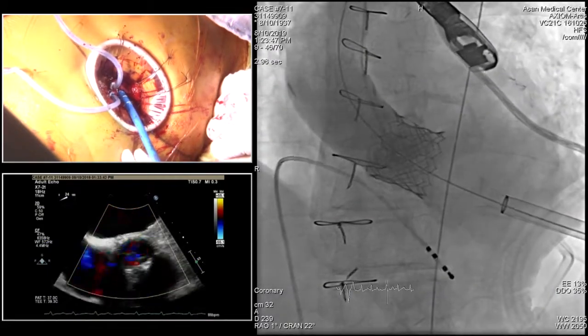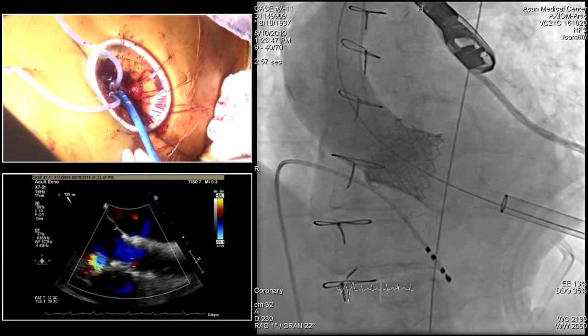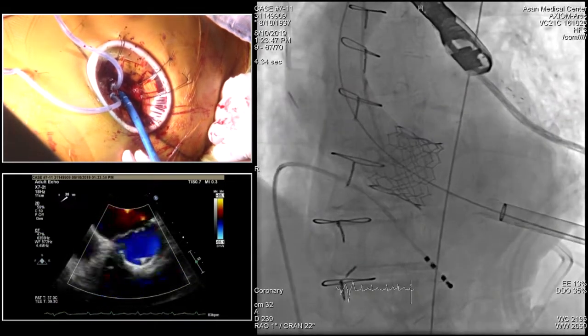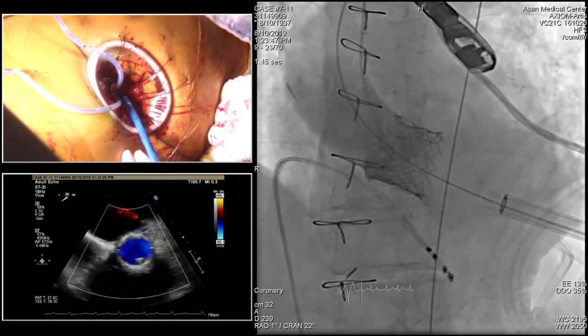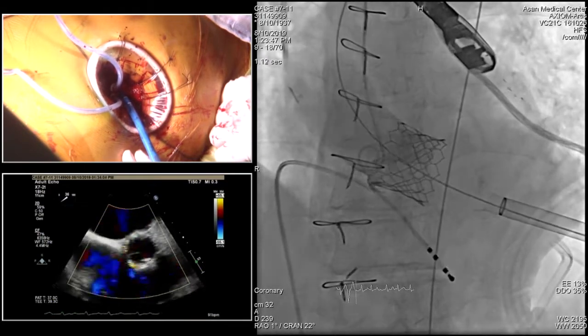17, 그럼 2 cc로 맞춰주세요. 2 cc 오버필. Okay, we're going to do 2 cc. 그럼 18%. So you're gonna do post dilate? Yes. 17%. I'm gonna do 2 cc overfill. 예. 아까 2 cc overfill 한 거였어, 그게? 그러면 1 cc만 더 하세요. Okay, got it.